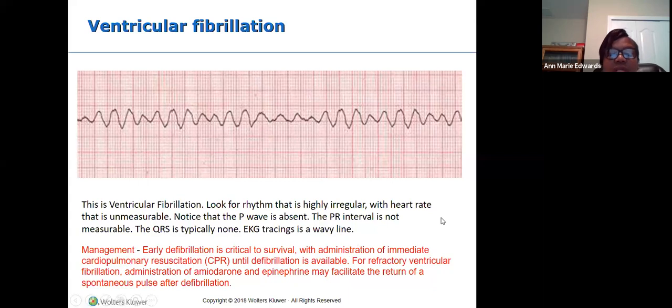So note your drugs that you give for these different conditions. Sometimes you're just given these waves in your exams, and then you will be asked, if a patient presents with this wave, what medication could be implicated for this patient.